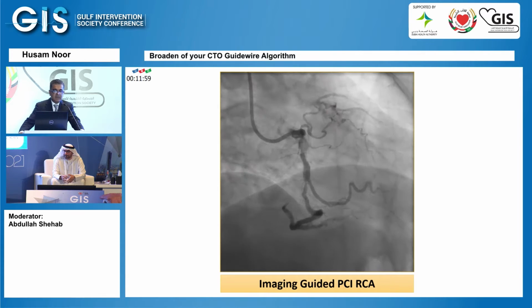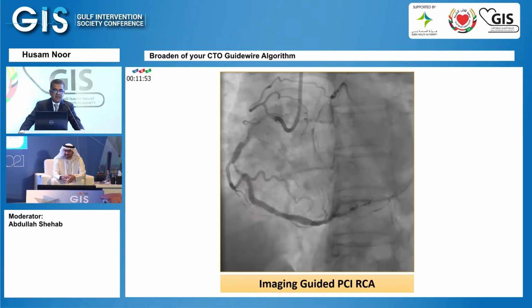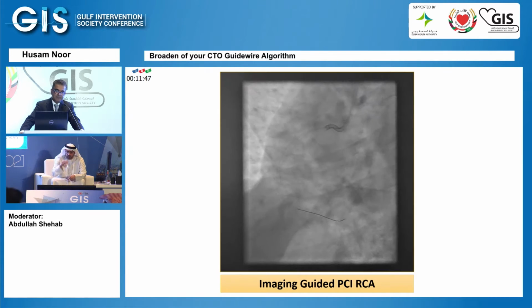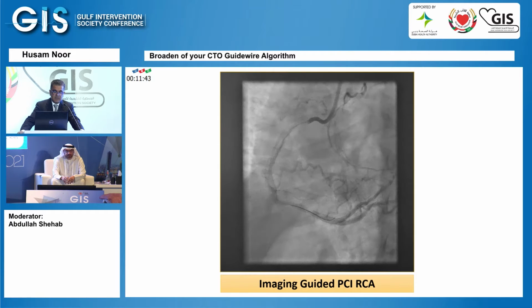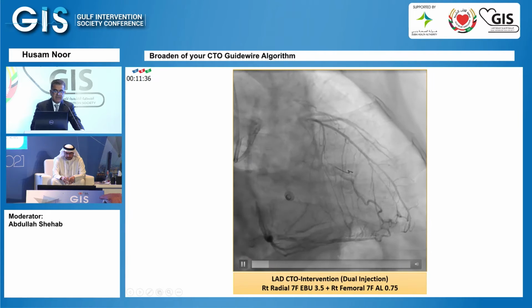So my colleagues proceeded with the image-guided PCI of the RCA. The guide was an Amplatz because we thought at that time we needed some support due to the calcium. This was intervention as usual. Then he was brought back to perform the CTO of the LAD.